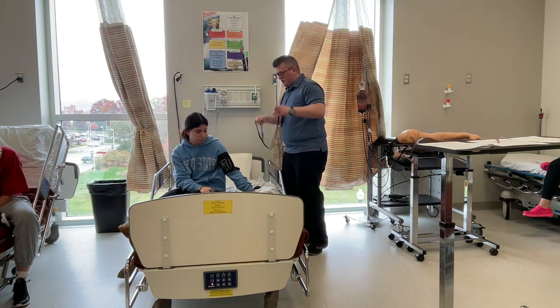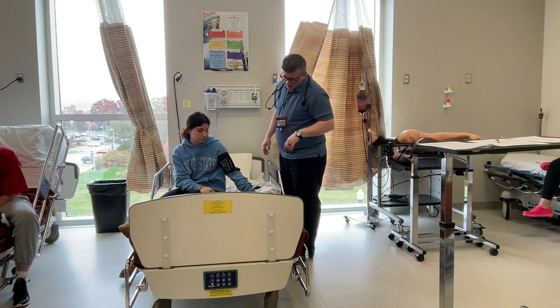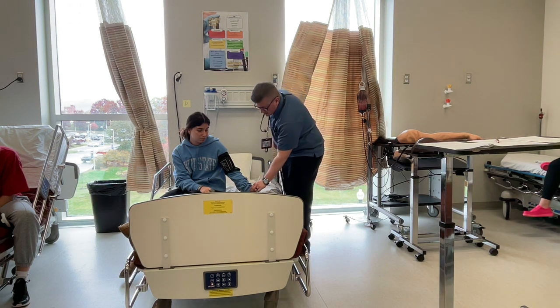Alright, so our blood pressure is 120/70. Our pulse ox is 96% on room air, and our pulse on the pulse ox is saying 80. I'm just going to confirm with our radial pulse.